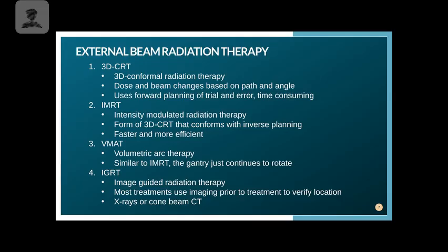And then what it's going to do is it's going to break down all of the angles after we determine our dose. So it's going to basically work backwards, saying I can do this many angles to avoid these tissues and still get this much dose to certain areas. So this is much faster and it's also more efficient.